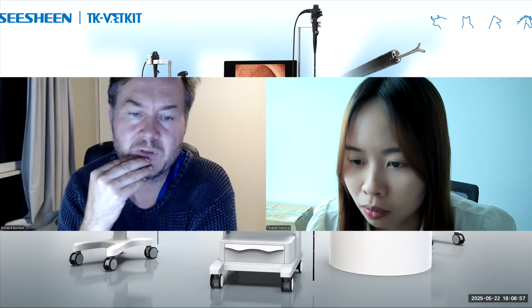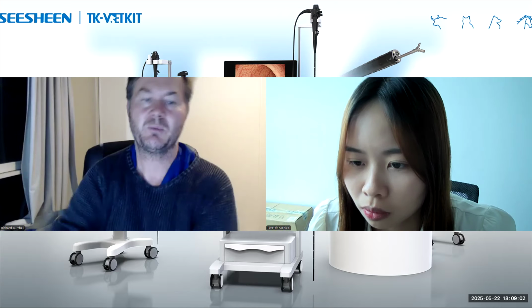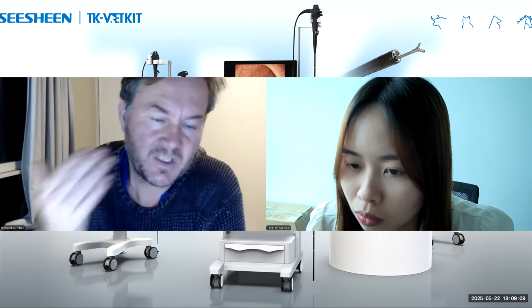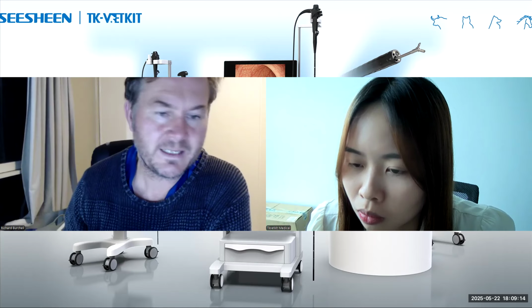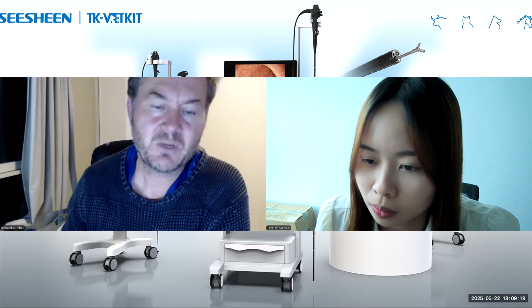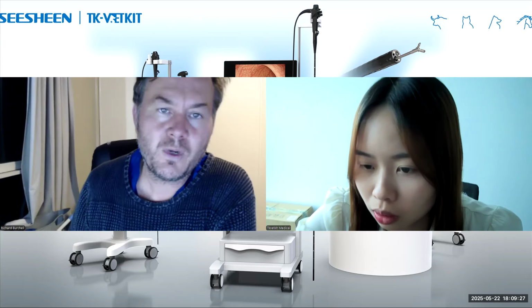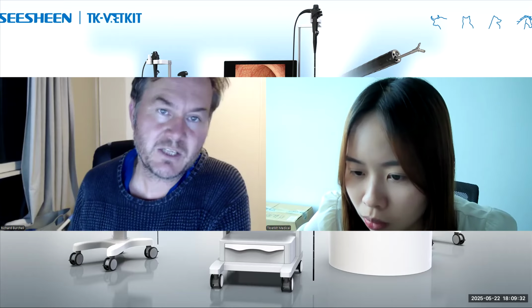It's a very broad topic, because you might be doing an airway exam because you have a collapsed trachea and the dog is dyspneic, and under those circumstances you probably want to avoid anesthesia and endoscopy unless you have an emergency stent that you can place, because often you can't recover those cases once you've done endoscopy on them and they've been under anesthetic. So I generally avoid the respiratory distress patients for endoscopy.